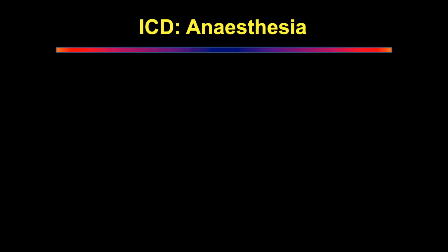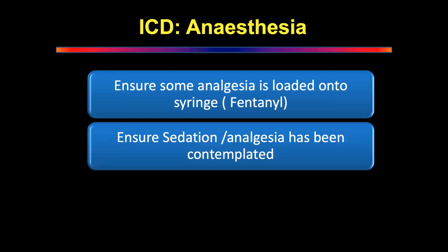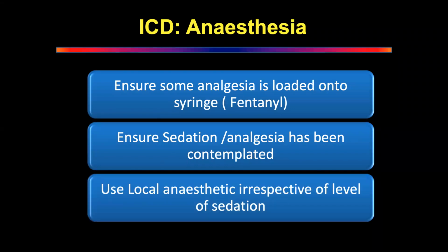Anesthesia. Local anesthesia. Thank you very much. So make sure that you've got analgesia already loaded. Make sure you've got sedation and analgesia which has been decided. And should you use local anesthetic if you have sedated? Yes, sir. Yes. Always use local anesthetic irrespective of the level of sedation.